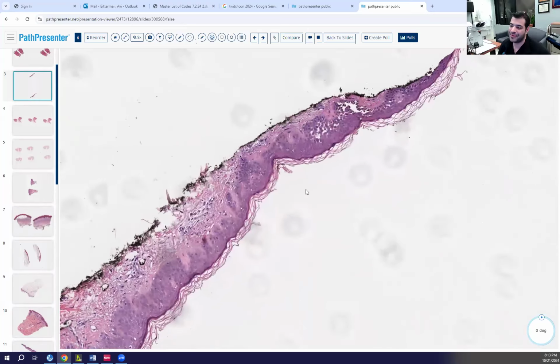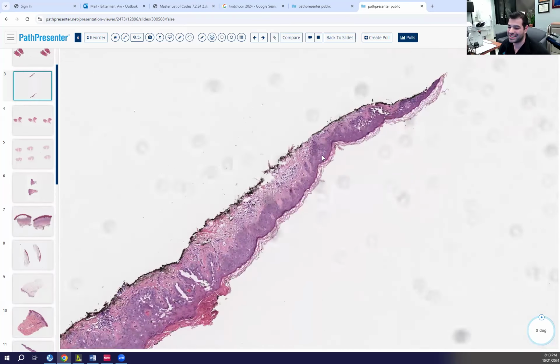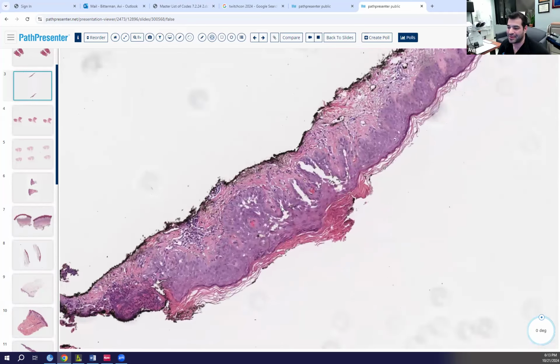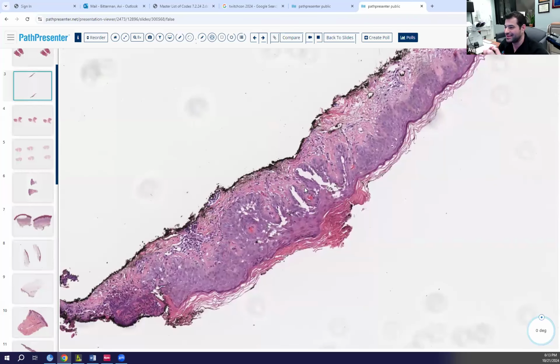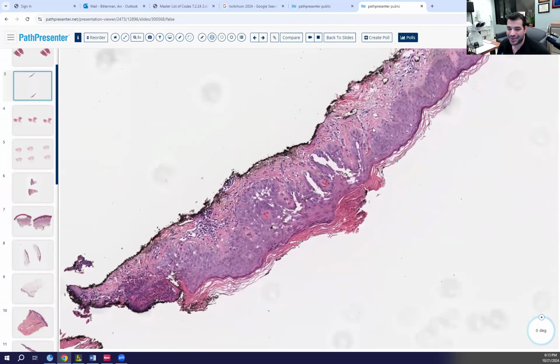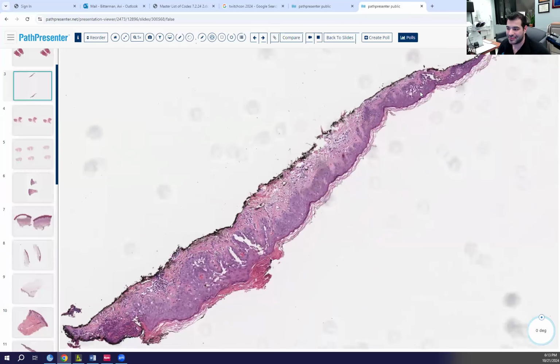And the Elstonism for this is that they have a tendency to make the red corps ronds, the eosinophilic ones. They don't really make blue ones, and you typically just see a bunch of corps ronds, and you don't really see them becoming fully dead reds. We'll go through some examples. And what about Darier?